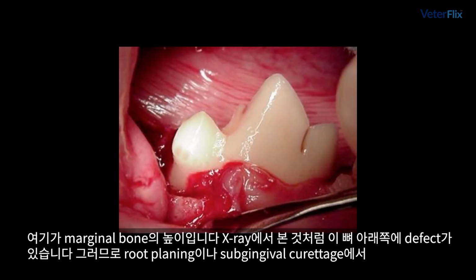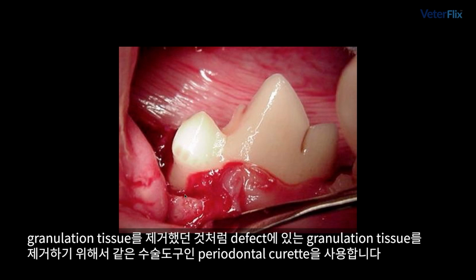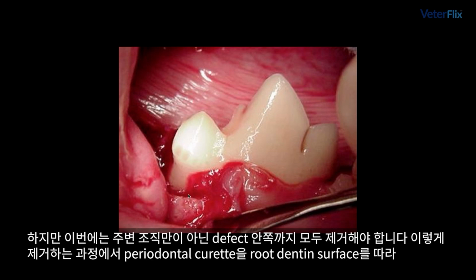So here is that marginal bone level that we just saw on X-ray, and down in this bone is the defect. So we use that same instrument, the periodontal curette, to remove all that granulation tissue out of that defect. We do our root planing, and we do a similar procedure to the subgingival curettage, where we're removing that granulation tissue, but now it's not just adjacent to the tissue, it's down in this defect.